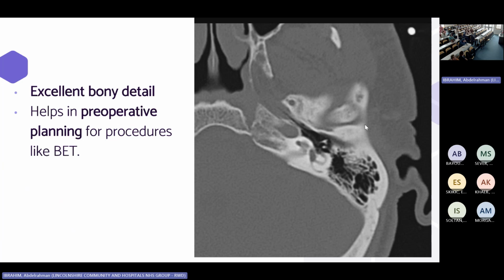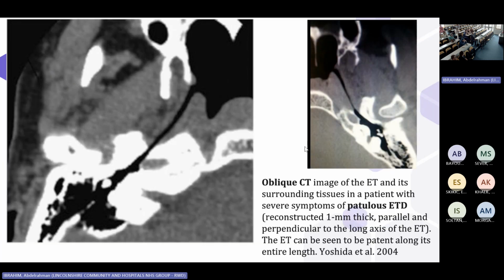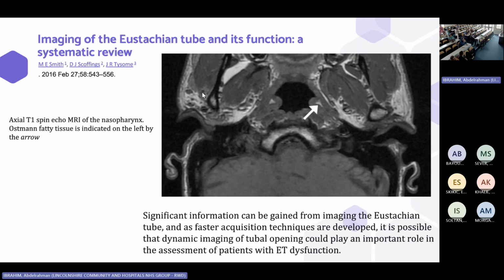This is a CT scan, axial cut. We can see here the air cells of the mastoid, and here the middle ear, with the ossicles. This is the cochlea, and this is the bony part of the Eustachian tube. This is an oblique CT scan of a patient suffering from patulous Eustachian tube dysfunction. We can see the mastoid air cells, middle ear, ossicles, and the enlarged bony and fibrocartilaginous parts of the Eustachian tube.